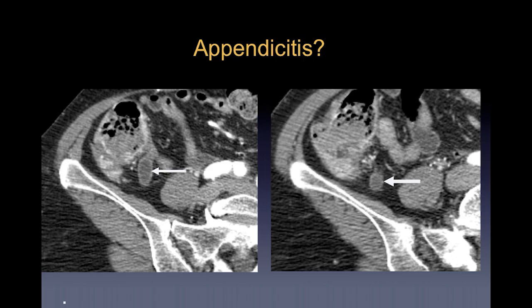But I think it's an unusual enough occurrence that when you see this, and this is what we did in this case, you are sort of compelled to get in touch with either the patient if they're still there at the scanner, make sure that they don't have abdominal pain, fever, any symptoms that could be referable to appendicitis, or get in touch with the referring doc and just make sure that somebody takes a look at the patient and that they are indeed okay.